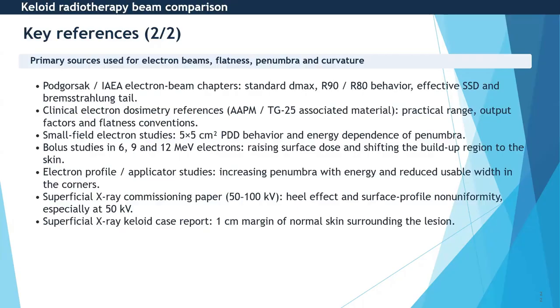Months ago, I had a patient with a keloid in the pubis, and after surgery, I asked for the patient to get electron therapy, and the physician refused because he thinks there would also be some influence on the ovary of the patient. I'm confused. Can you explain this for me? Thank you very much.